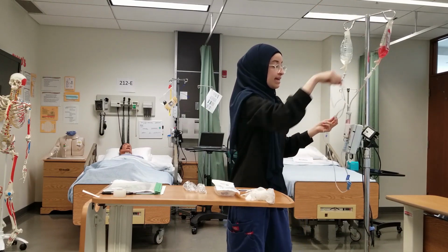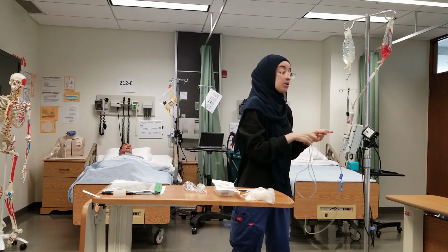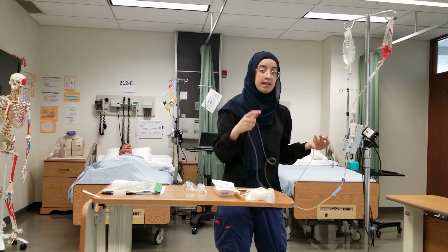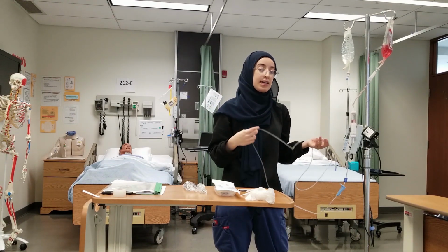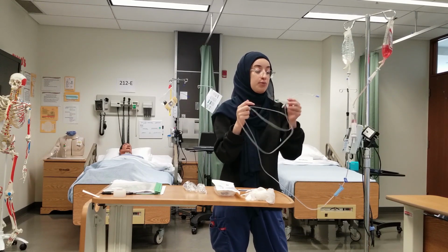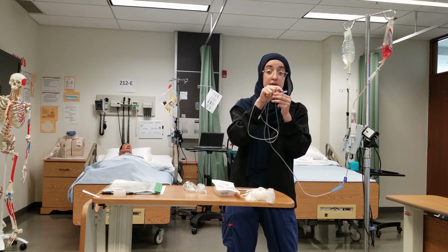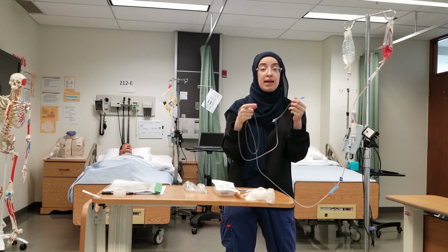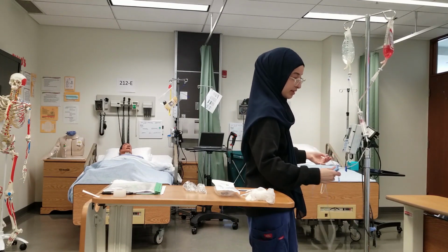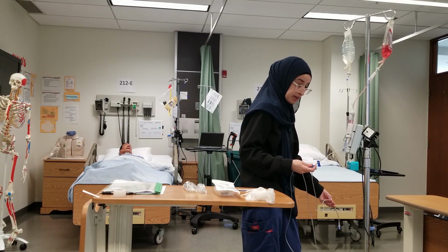The reason being is, as per policy, we have to stay with the patient for the first 15 minutes to assess for any adverse effects. And if we start that 15 minutes and the blood hasn't reached the patient yet, we're not doing an accurate assessment. So our 15 minutes starts when the patient first starts receiving blood. So if we have blood over here, I'm going to have to wait with the patient until I see the blood reach the end of the tubing, and then I can start the timer, and then I wait for that 15 minutes with the patient. So I'm going to go ahead and open my clamp, and I'm going to prime all the way through with my blood.